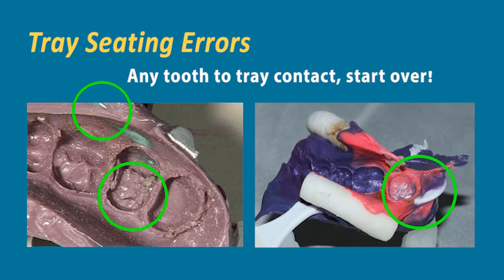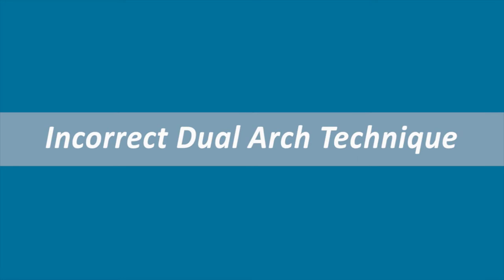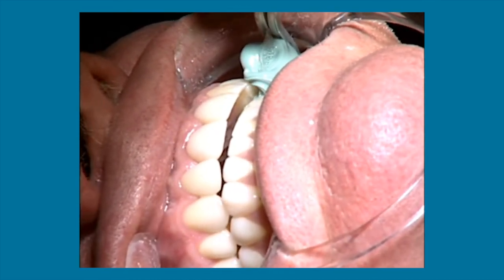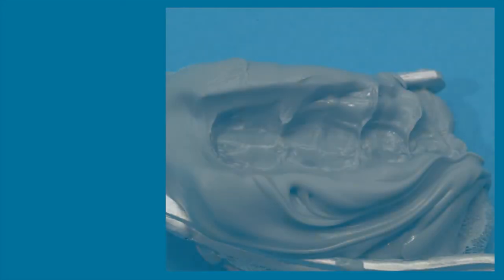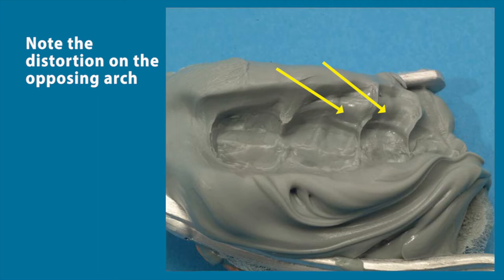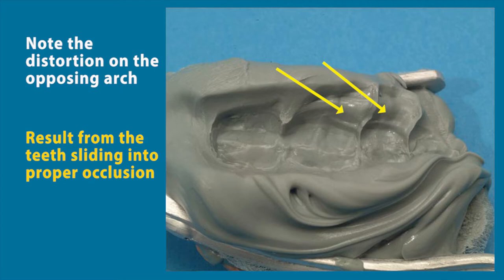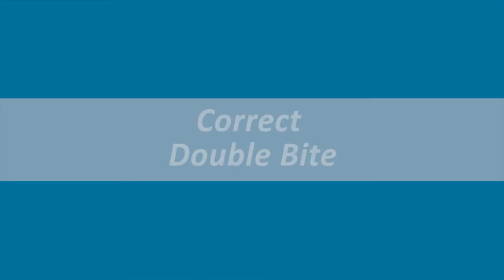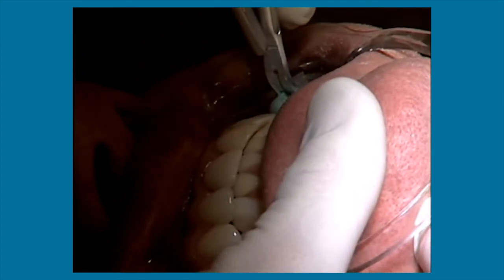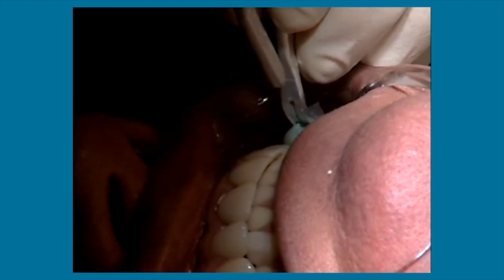In this video of the incorrect way of biting—notice how the patient slowly closes, then opens a little and moves over and closes again. That side-shifting is what caused those elongated, distorted teeth shown in the dual arch tray result. Now in the correct method: you load the impression material—light body in the mouth, heavy body in the tray—and direct them back into that same position straight down. Notice how there's no side-shifting; they bite right down into the impression material and stay right there.